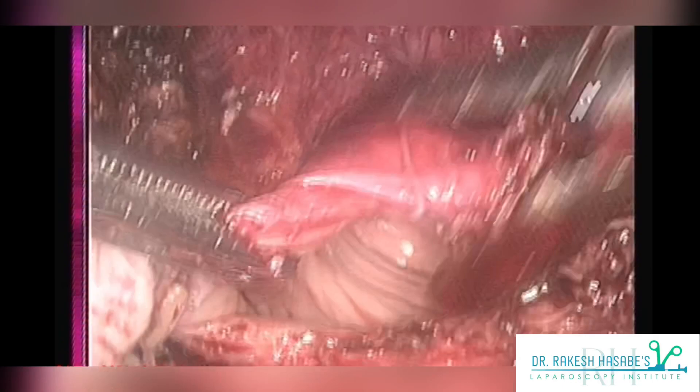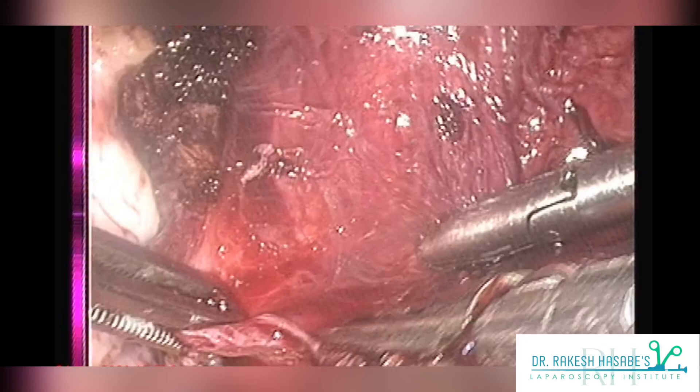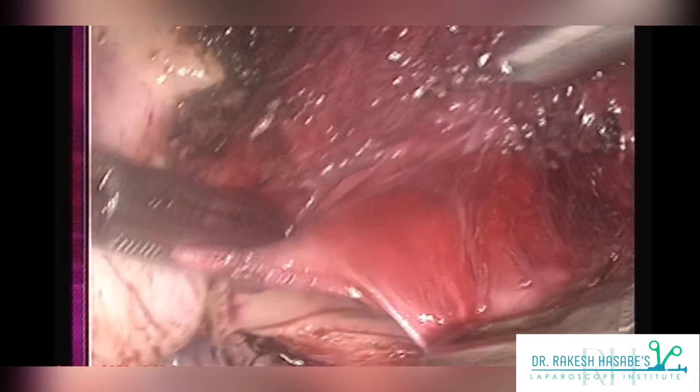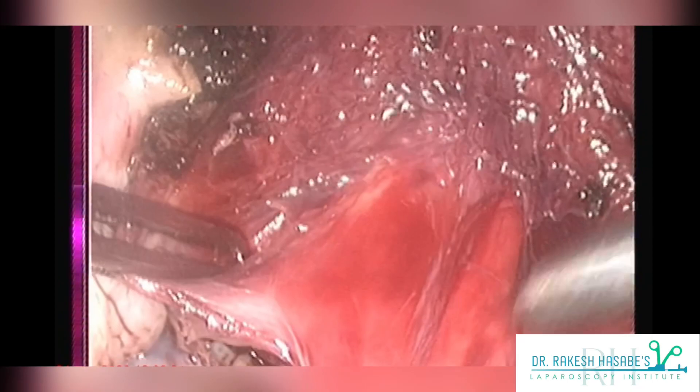Before actually starting your laparoscopic vault suturing, you should see that you have a clear vaginal vault margin of at least one centimeter anteriorly which is free of any bladder fibers. As you can see in this video, I am using a needle holder to push all the bladder fibers that might come in my way. This can be very efficiently performed using a needle holder, but you can use your instrument of choice — suction, scissor, or a plain grasper. The motive is to avoid including bladder fibers into your vault suturing.